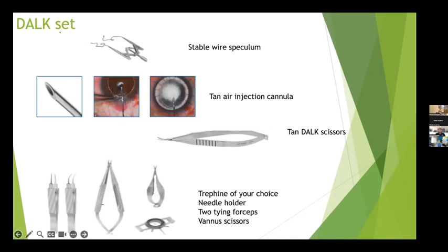I keep getting this question from colleagues who are starting DALK: what instruments, what equipment should we have in hand? This is just a summary of the instruments that I prefer. Different surgeons have introduced different instruments, and different surgeons have different preferences. Essentially, you need a stable wire speculum because you want good exposure of the ocular surface during the initial steps and also during suturing.